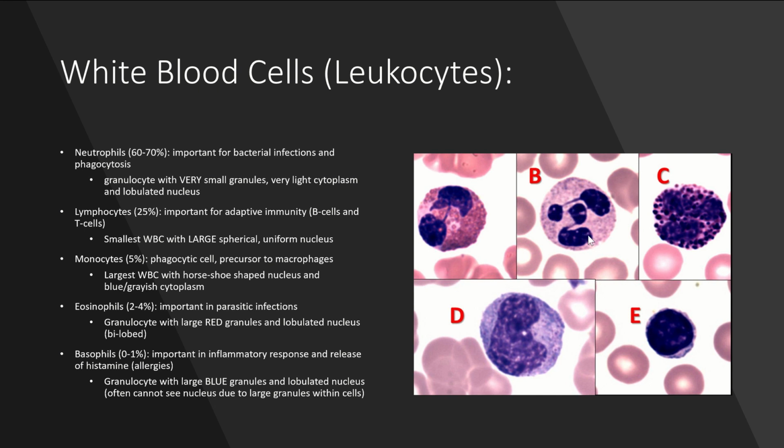So basically some parts of the nucleus are bigger and more expanded and some parts are condensed, and then it gets big and expands, condenses, and so that's what we call a lobulated nucleus, where there are multiple lobules or these expanded parts within the nucleus, and that is very common in a neutrophil, okay? And it just depends on the way that this nucleus is sitting, the way that it's orienting itself, how it's going to look. The nucleus isn't always going to look the same. They can vary a lot, but it is always going to be this crazy looking lobulated thing, okay?